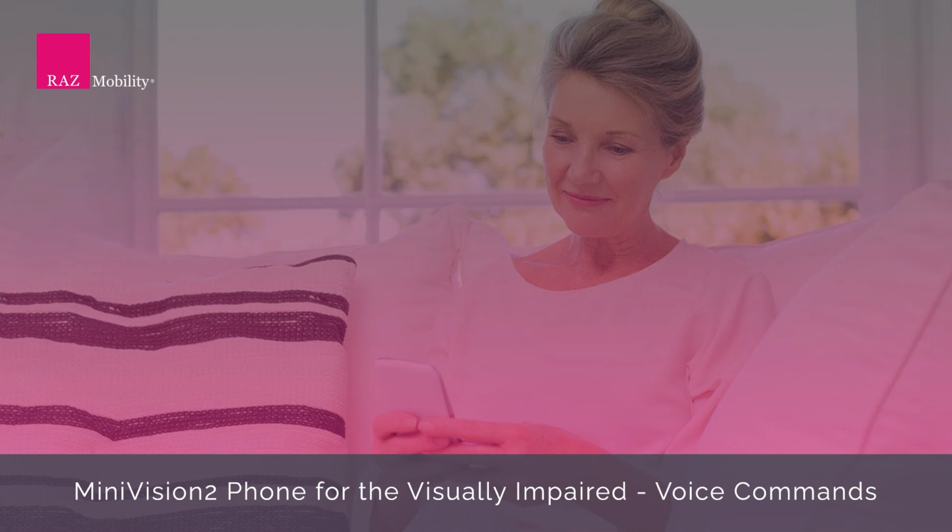Edit box. Type text message. So I'm in an edit box now where I can type the message. Me typing on a phone keypad, bad idea. I mean, I can do it if I need to, but I'm slow and I make mistakes and everything else. Especially if I'm typing a text message. Short things like names, I'm okay. It's when it comes to typing an actual text message. So we're going to use voice dictation.